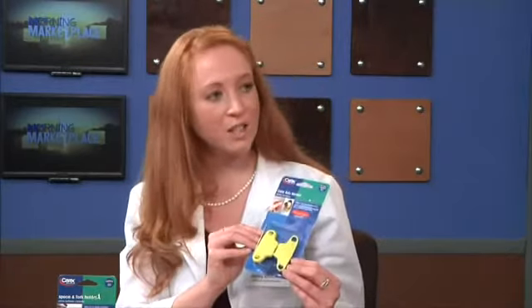Now, what about people with arthritis? Patients with arthritis, it's a little bit difficult to grab small objects and turn small objects, such as a key. We have a key turner that you can add to the key to make it just a little bit bigger for you to be able to turn the key. I think that's so important because I have an aunt who suffers from arthritis, and she, little things like putting on jewelry and, you know, just squeezing her hands together to do things around. These items are really lifesavers for older adults out there.